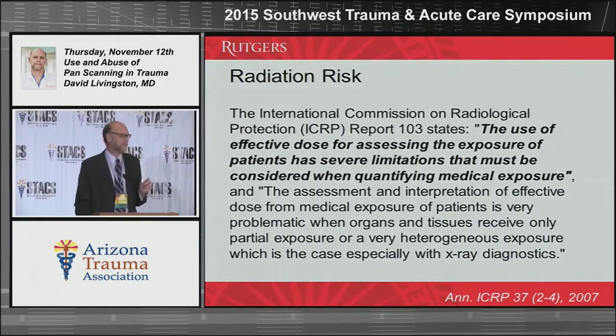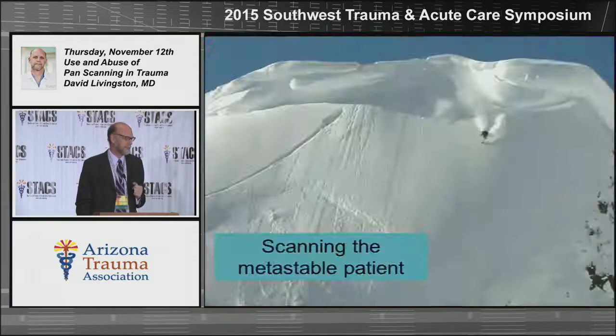I think you need pediatric protocols. For example, it drives me crazy in my center for maxillofacial CT. I use the head CT to screen it. Almost no one ever needs a maxillofacial CT unless their face is completely smashed in, and my colleagues need it for planning reconstruction. Most of them don't. It drives me crazy to see an isolated maxillary sinus fracture or a nasal bone fracture diagnosed with a dedicated maxillofacial CT. So we've tried to limit that. And again, I'm talking about these per se.